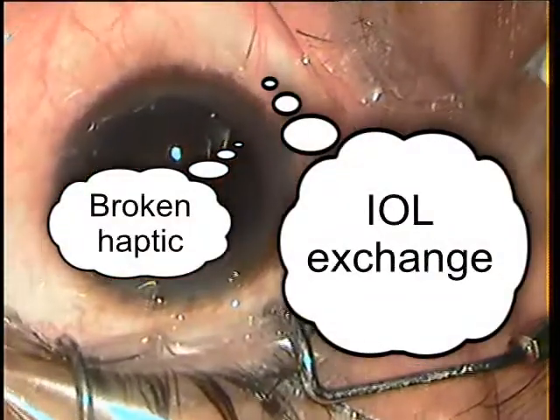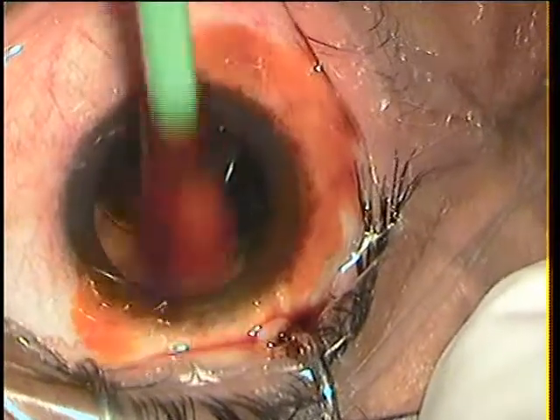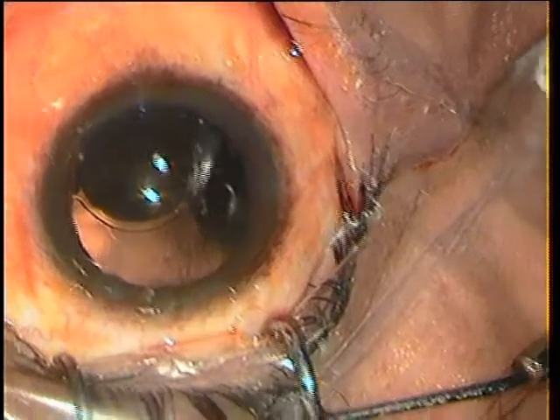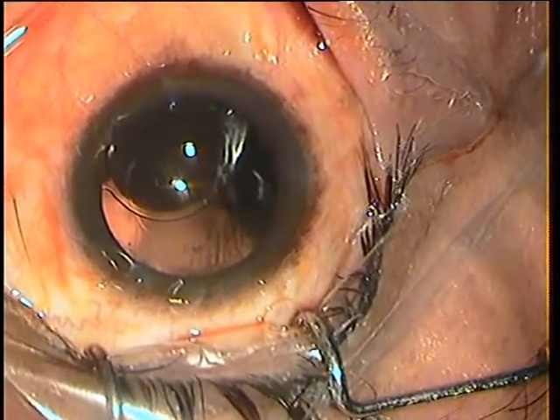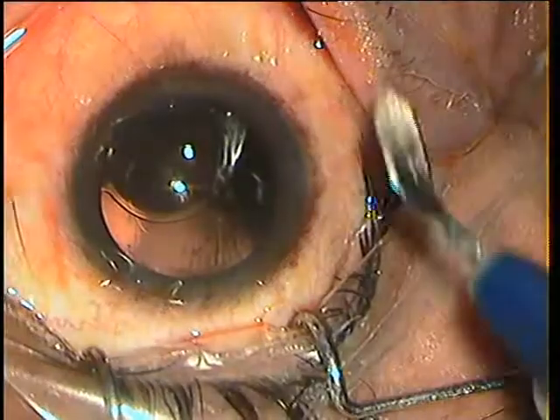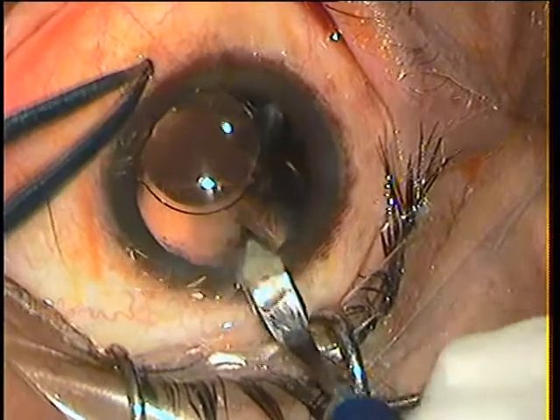Dear friends, a broken haptic in IOL implantation is not unusual, and this was one such case. The leading haptic got trapped in the cartridge and was truncated. When I implanted, I saw that the lens had subluxated downwards.